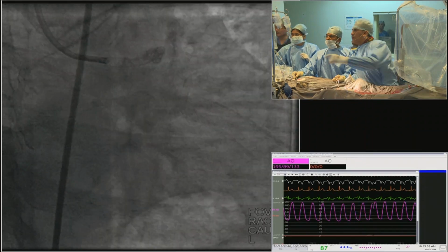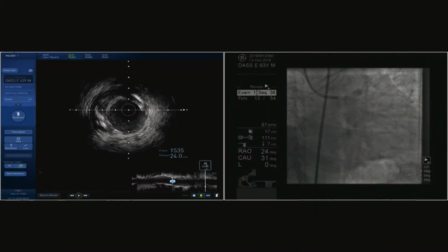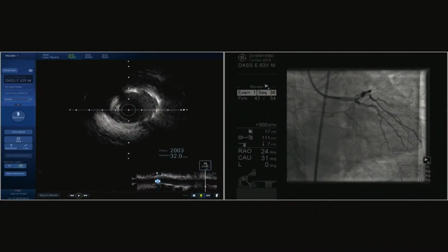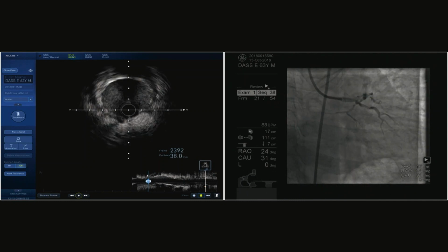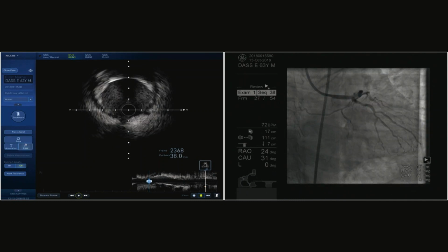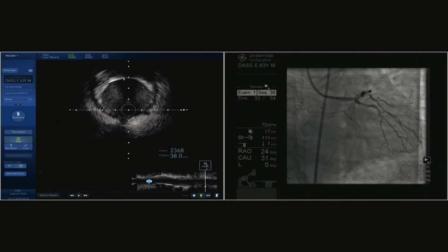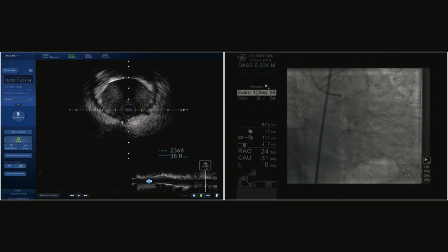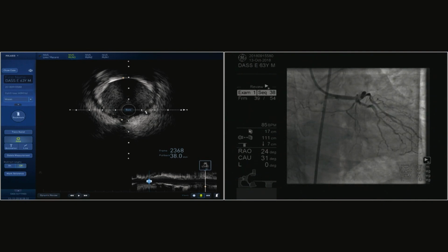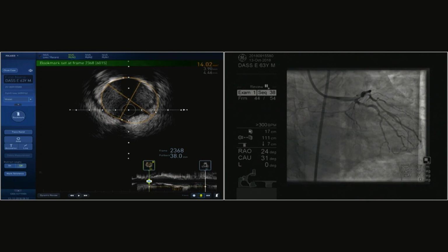Okay. Can you do a left main MSA? Yep. Remember that the distal, and I can even visually see it from here. He's talking about the bifurcation point. That's right. Angiographically this one does not appear very pretty, so the polygon of confluence has not been actually treated appropriately. You know, you expect the POC, and only the proximal end of the stent seems apposed in the left main, but the rest of it is clearly underexpanded. I would not be hesitant to say that I would be worried.